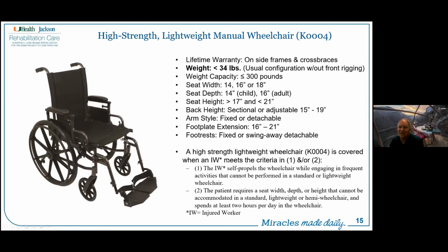Now, ultimately, these are Medicare, Medicaid guidelines, and guidelines that most insurance companies follow along. A high strength lightweight chair is covered when an injured worker, that's IW, so this is typically associated with workman's compensation, meets the criteria in 1 or 2 below.